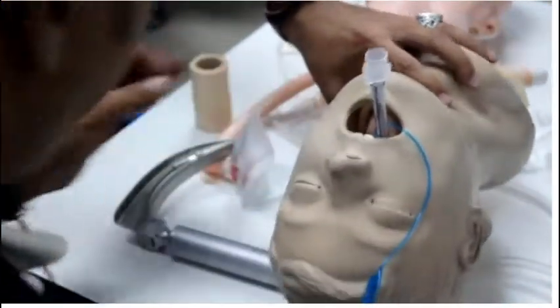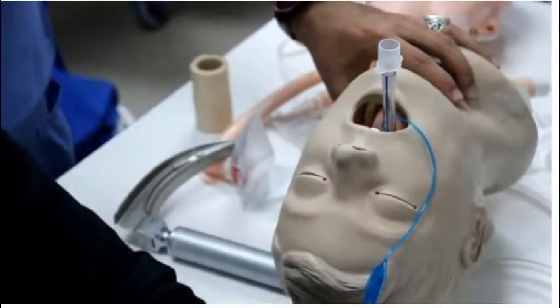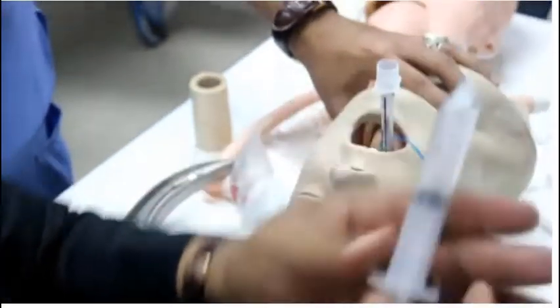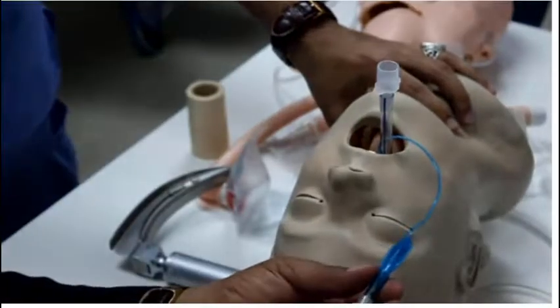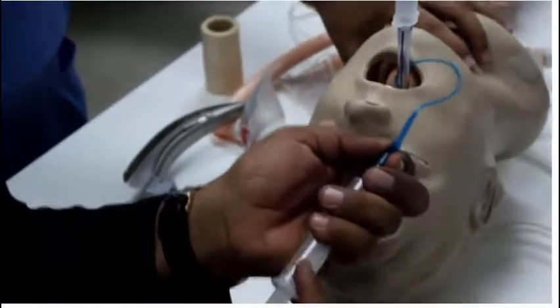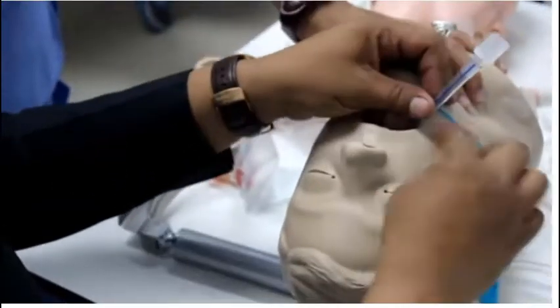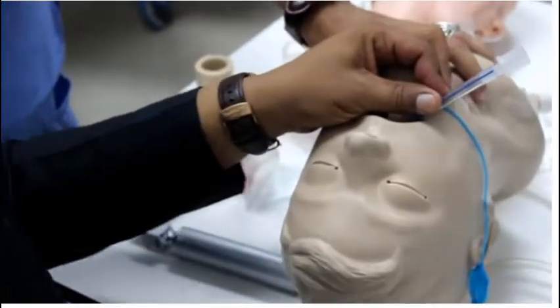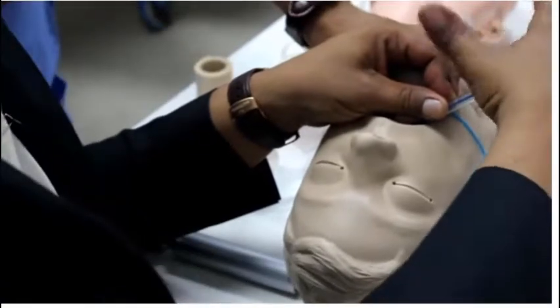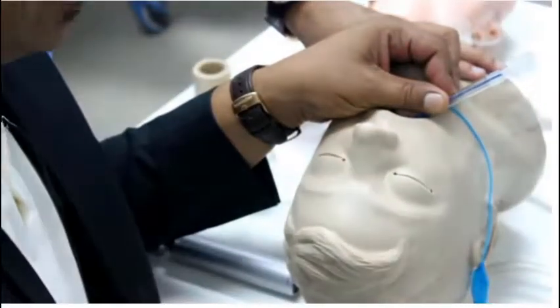Just after this maneuver, you have to take an air about 8 ml and push on the valve and inflate your tube. And put it out. Now it is safe, fixed. And you should fix it on the side of the patient. You should put an Ambu bag here, inflate and auscultate on either lung, auscultating by the stethoscope.